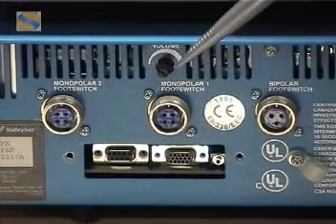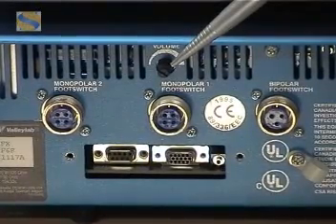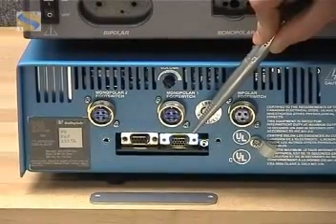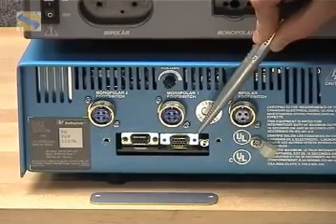Also located on the back panel is the volume control for the diathermy activation tone. Finally, there is the RS-232 interface port, which is normally covered by the blanking panel shown below.